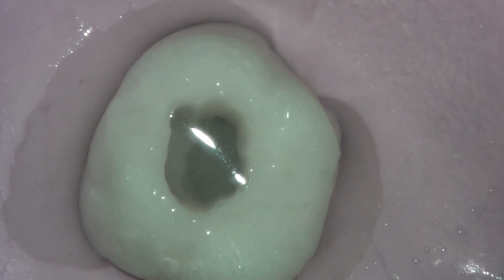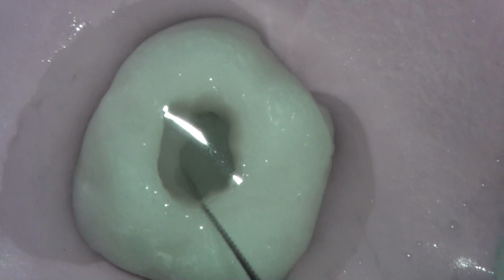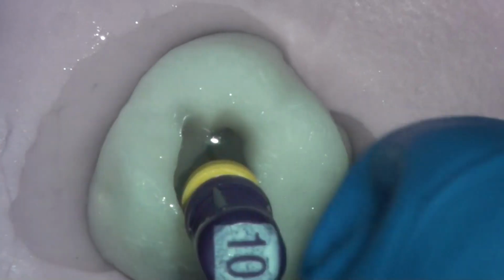Once we establish a length, we now switch to our 25mm size 10 hand file, measured at 21mm. And we are going to introduce that in, confirm that we can get to length, and also establish patency at 21.5 mils. And so you can see the action. This file is quite rigid, it's quite stuck in the apical portion, so we have got a little bit of work to do.